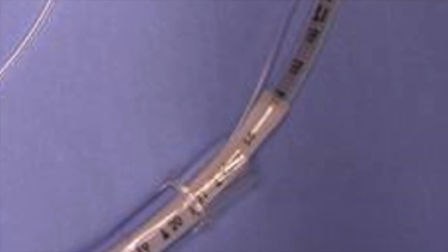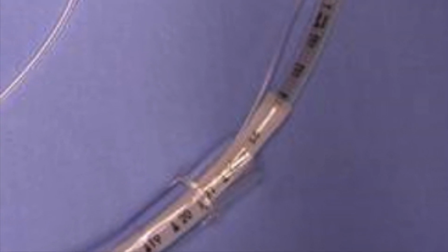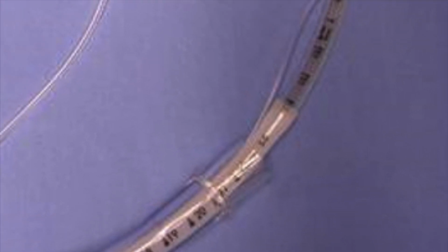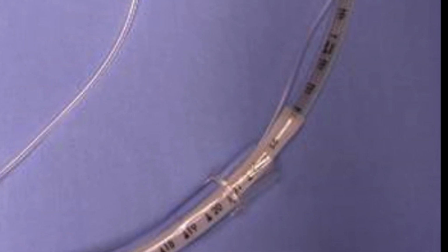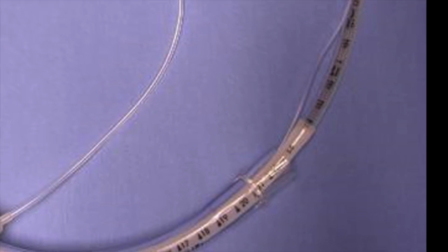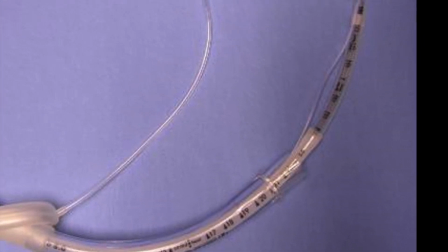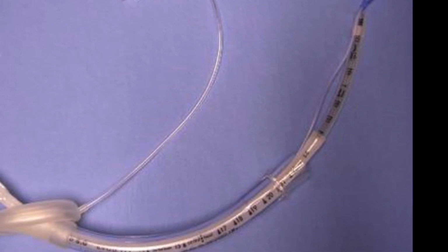tracheal tubes. This shortened extra tube still permits continuous airway support during the removal of the supraglottic airway from the mouth. Once the device is removed from the mouth, then the circuit connector is removed from the tracheal tube extender. This enables complete removal of the supraglottic airway device over both tubes, as the pilot balloon is now positioned just above the stabilizing tube as they travel through the conduit during removal.